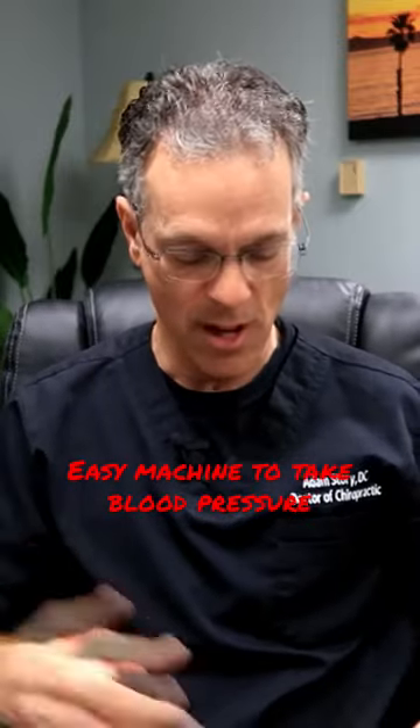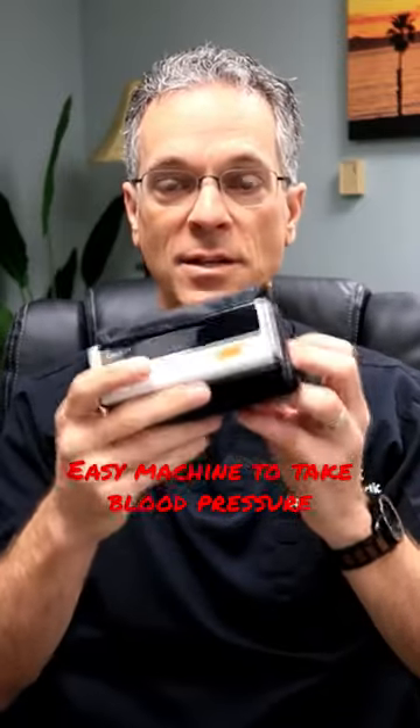So let me show you how I would use something like this. This is a neat one because it's just so simple — all you're going to be doing is hitting this button.